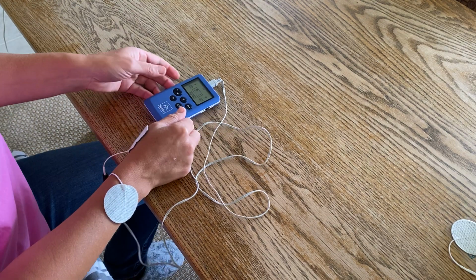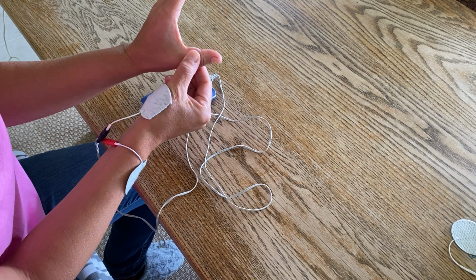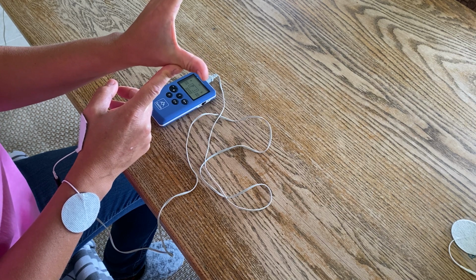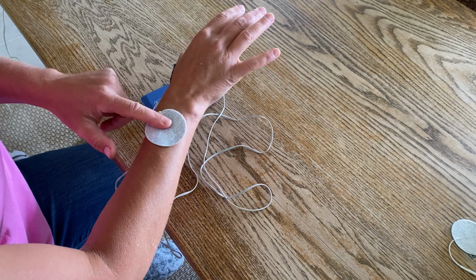In this video I'm going to show you how to use electrical stimulation to work on stretching and opening your thumb up in preparation for getting around an object and grasping. So for electrode placement, I'm just using one lead.